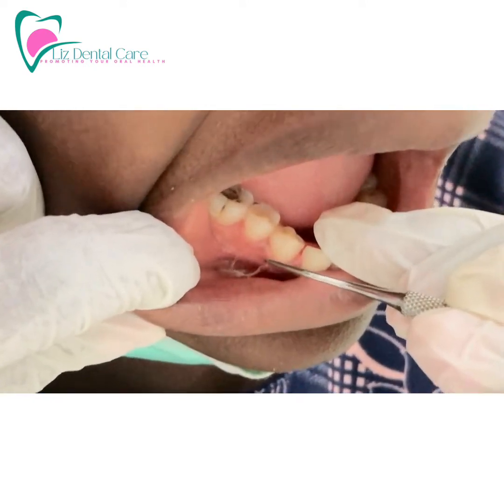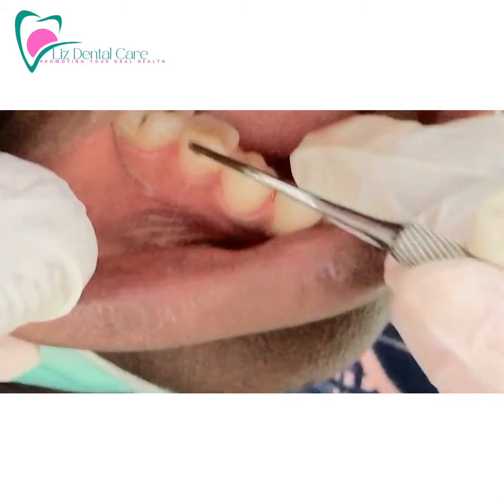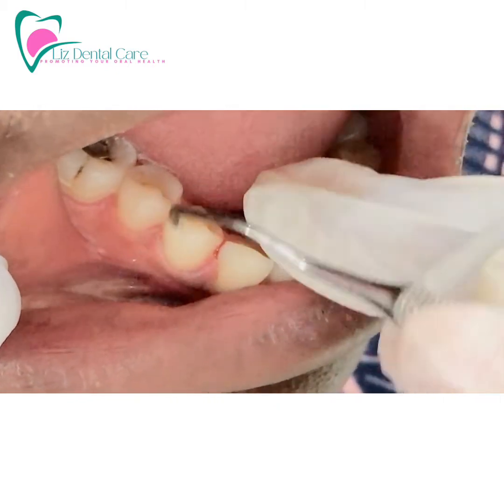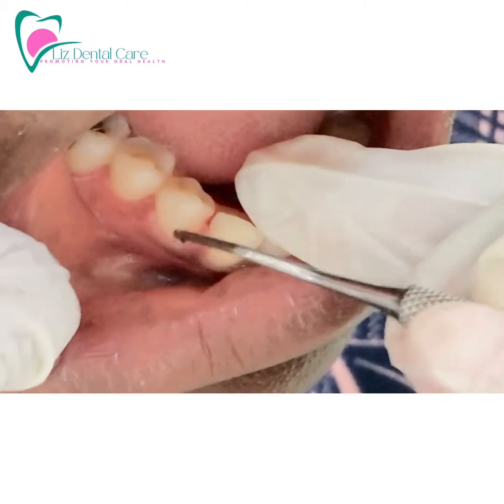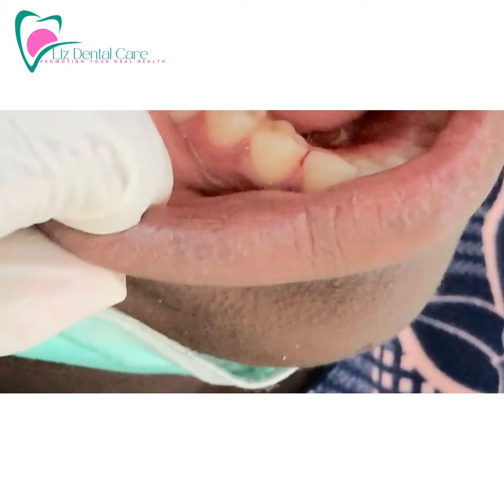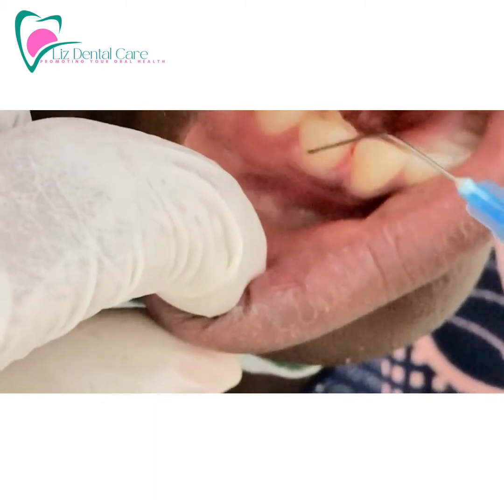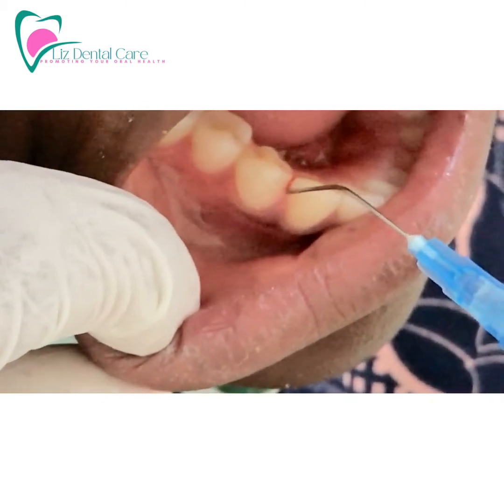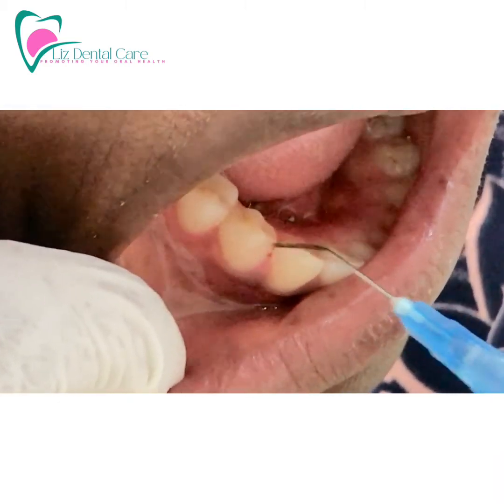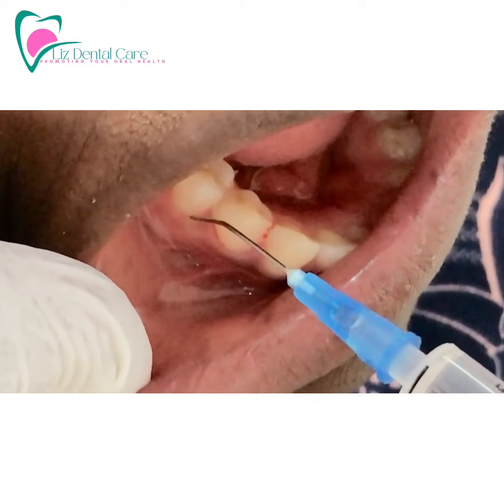This is the deep cleaning under the gum. The first thing you should do before flushing with the solution is to scale under the gum gently. You only scale where there are pockets. Then use the syringe with the solution to flush out the areas under the gum that have been cleaned.